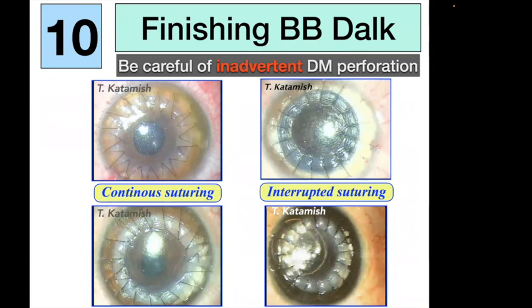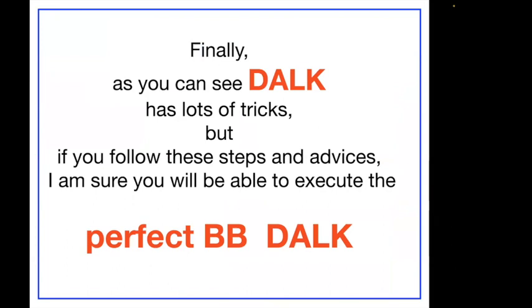This is surgeon preference. Finally, as you can see, DALK has lots of tricks, but if you follow these steps and advices, I am sure you will be able to execute the perfect big bubble DALK.